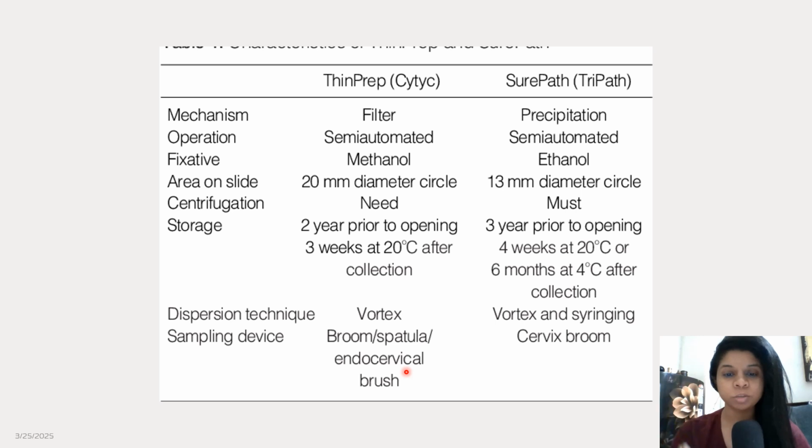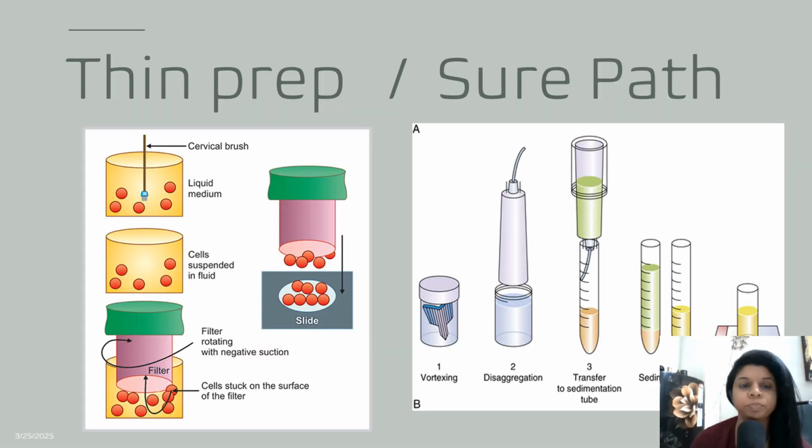Anyway, 100% of the cells that are going to be collected are going to come in the preservative fluid. So the brush or the instrument isn't a much difficulty thing in ThinPrep. So these are the methods that we use for ThinPrep and SurePath.